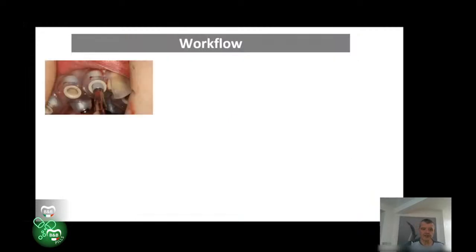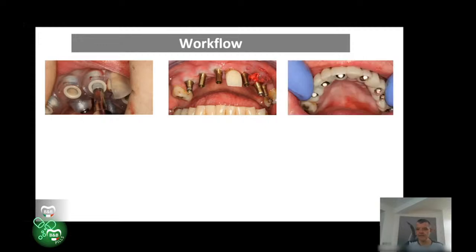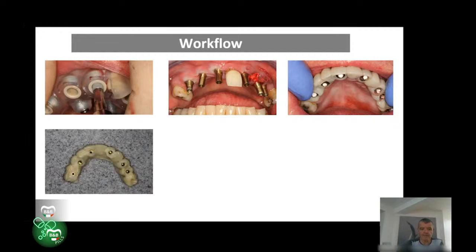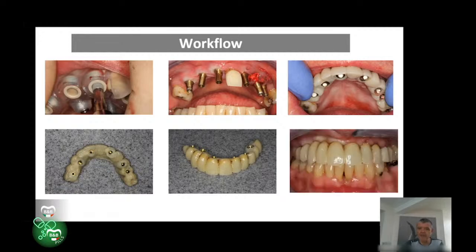So we then went to surgery. We placed all of the implants transmucosally. After we placed the implants, we did a little bit of grafting here. We fitted the MUAs, and we fitted then the temporary bridge cylinders. We tried in the temporary bridge and checked the occlusion, which I was very pleased to see was absolutely perfect. So we picked up the cylinders with some resin, did our final trimming, finishing, a little bit of staining and glazing there, and fitted the restoration. So I was quite happy with that as my first case.